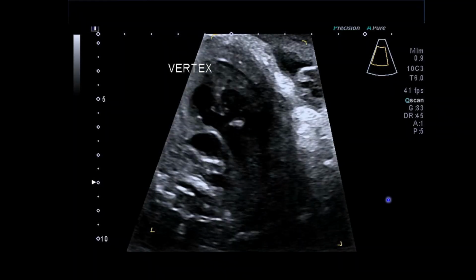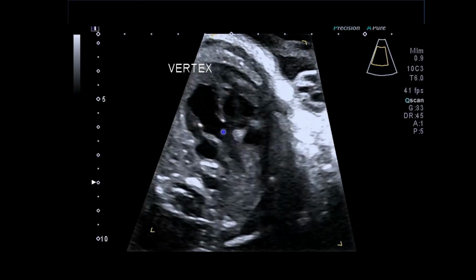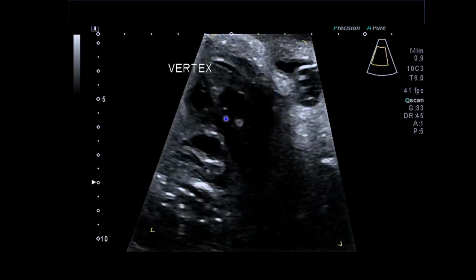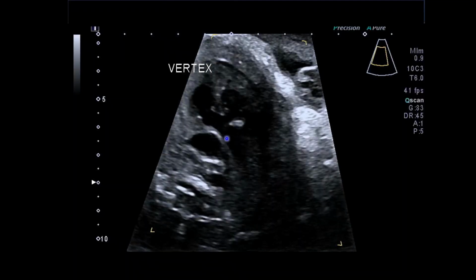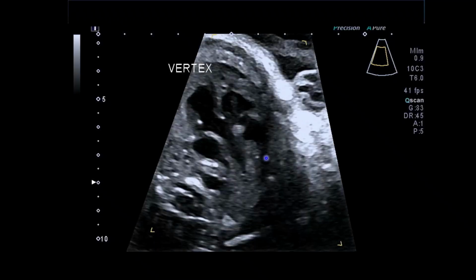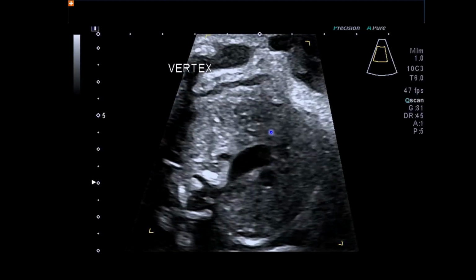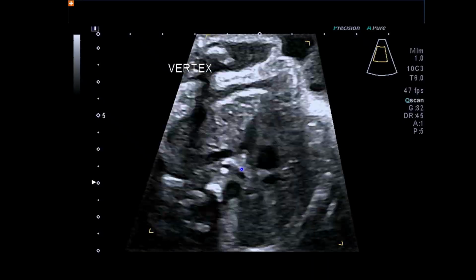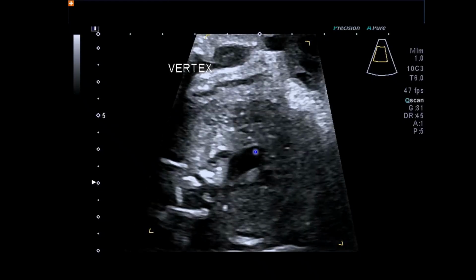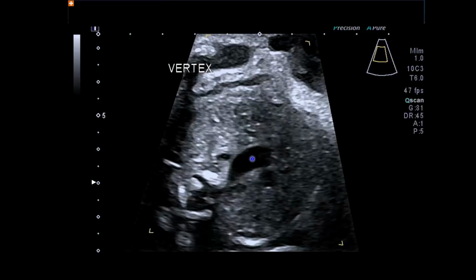So we start out in the axial four-chamber view here. We're seeing a single outlet. This is the aorta, and there's a large subaortic VSD. We call this an anterior malalignment VSD because there is aortic override of that VSD. And as you transition forward to the upper chest, three-vessel tracheal view, you start to see the SVC, the aorta here, and you can see part of the main and branch pulmonary arteries here.